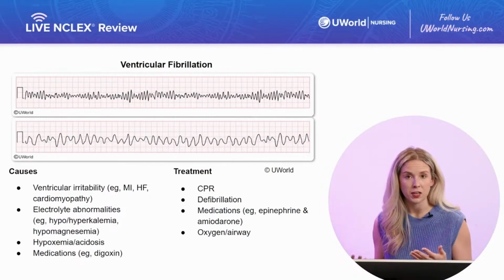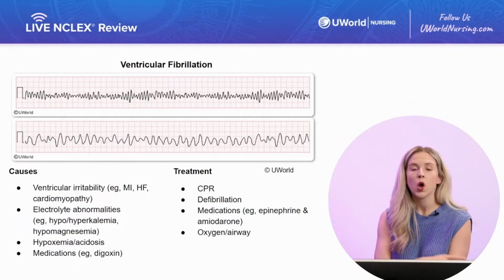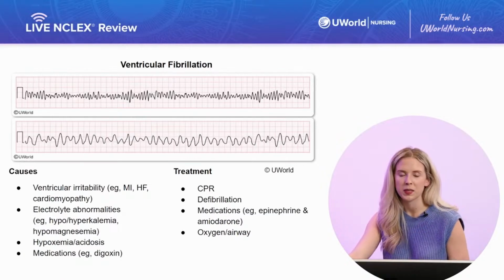So most likely intubation is how we're going to do that. And then we want to make sure we correct the underlying cause, whether that's an electrolyte imbalance or maybe acidosis. Alrighty, so all in all, we defib VFib, and whenever the client is pulseless, we're always doing CPR.